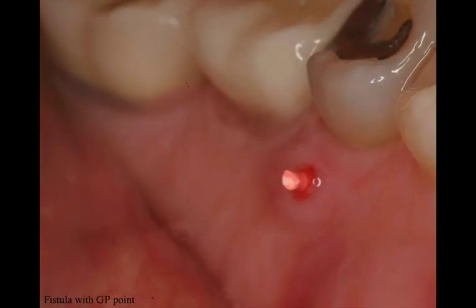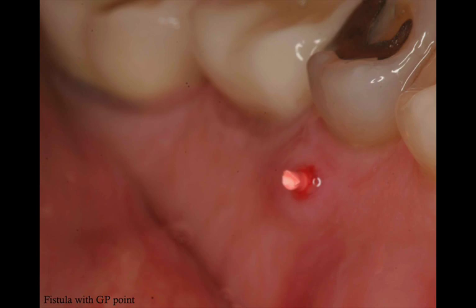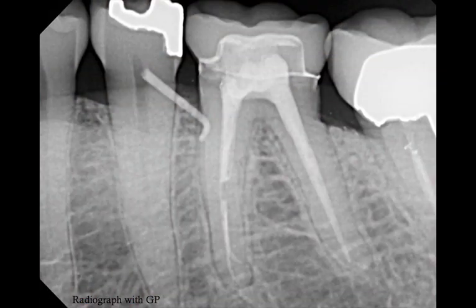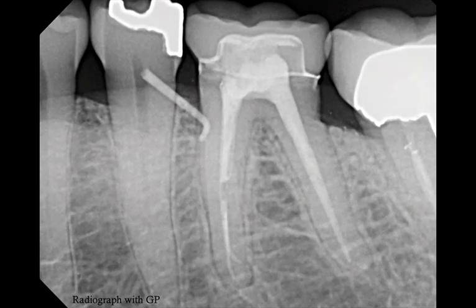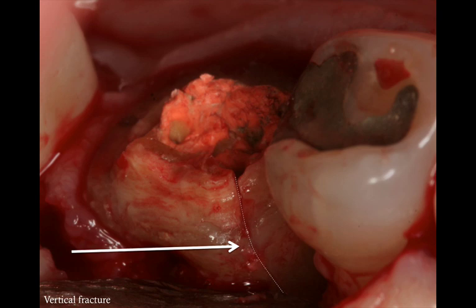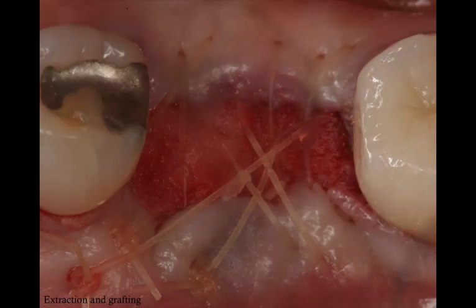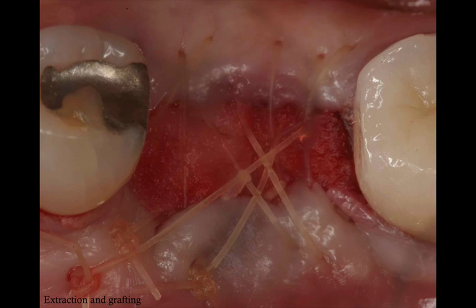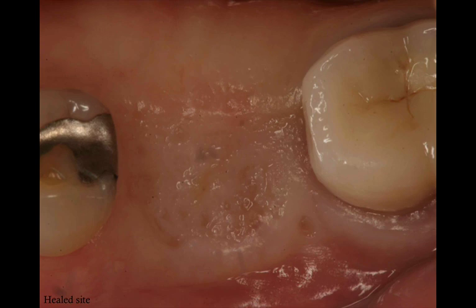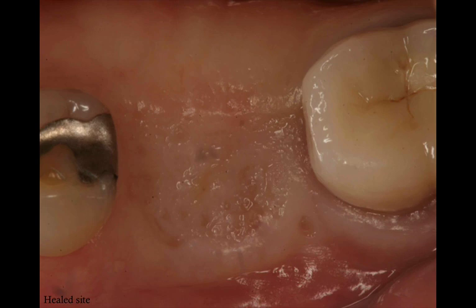For this patient, they presented with a draining fistula on the lingual aspect of teeth number 20 and 19. In order to trace the infection I placed a gutta-percha point and performed a periapical radiograph, which led me to tooth number 19. When I reflected the flap I noticed a vertical root fracture on the mesial root, so the tooth needed to be extracted, the socket was grafted, and I left it to heal for about three months. After three months the healing was very good, with enough attached keratinized tissue — a great implant site.